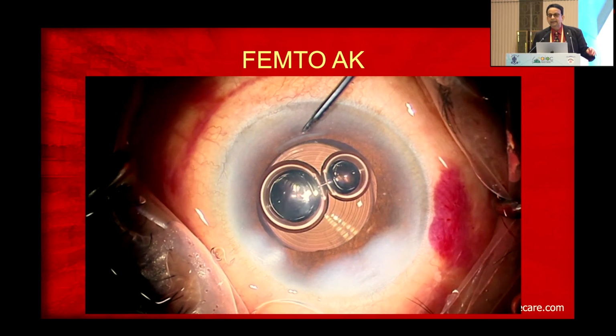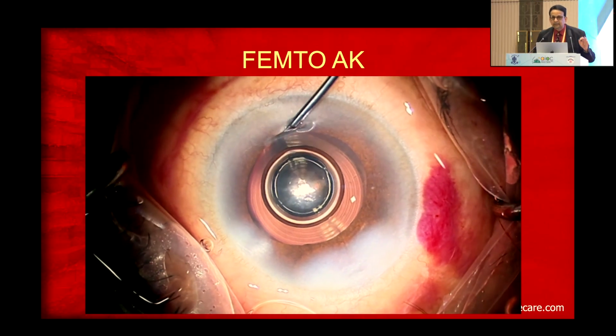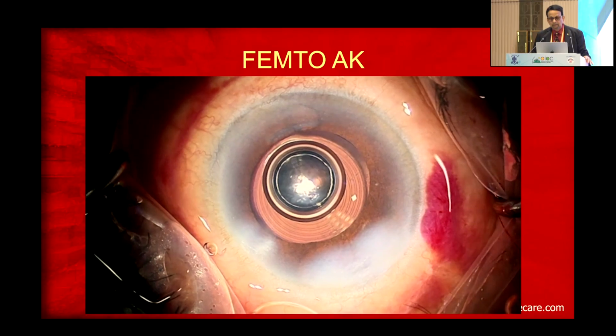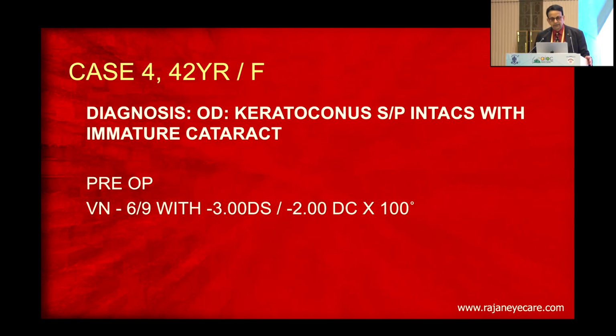Just to show you the AK, what we do with the femto platform is much more predictable than the LRI that you do manually. So for small cylinders up to about 0.5, 0.75, I'll do the AK as well, and the patient did very well.